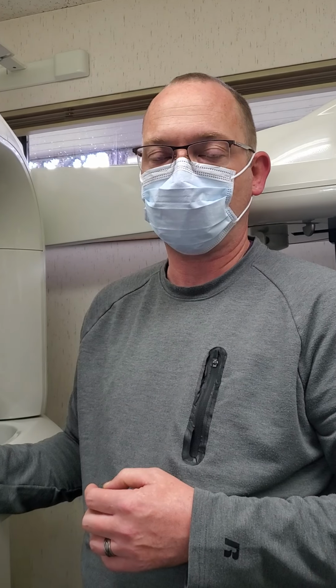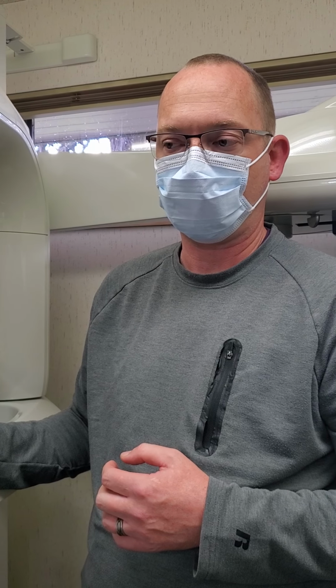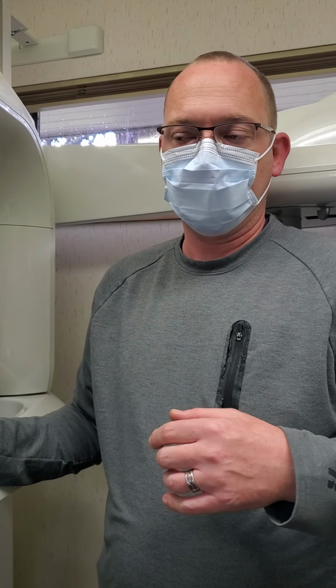Is it always a forward motion? Because I know some panos, they move forward and back, and you have to wait till that little back motion to let go. Is this just one continuous motion, or does it do that? It does just like the pano, where it will come around and then kind of reposition, and it'll tell you to release the hand switch. Okay, then it'll go again. Then you can release the hand switch.